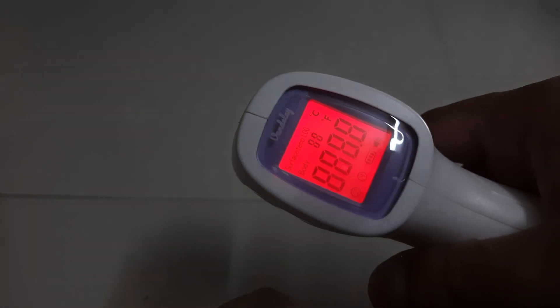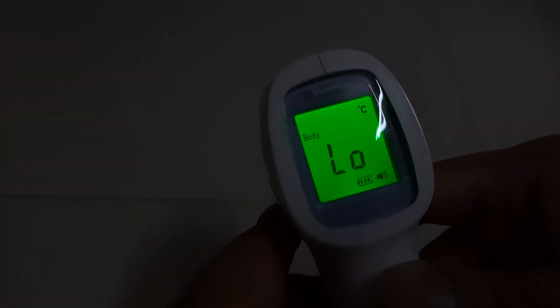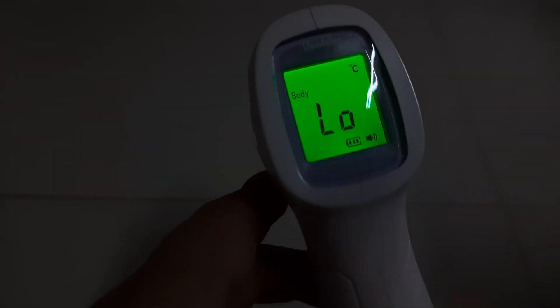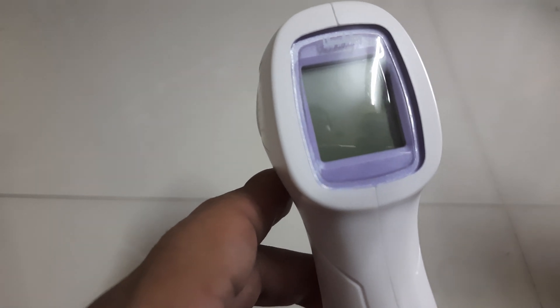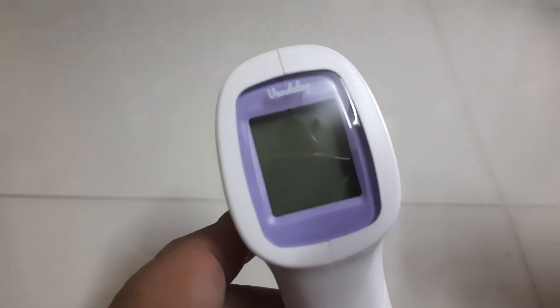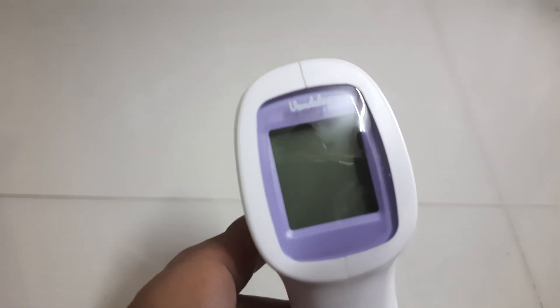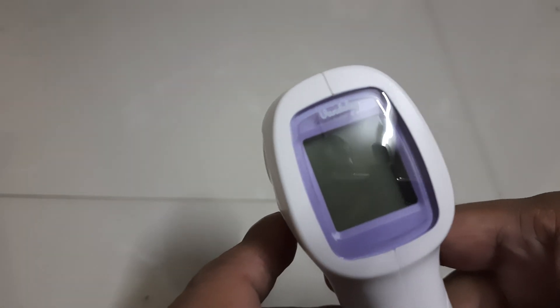When you activate it, you see three light indicators. Green means the body has a normal temperature. Orange means the body has a bit of a feverish temperature. Red is an alert — it means you need to visit a doctor.